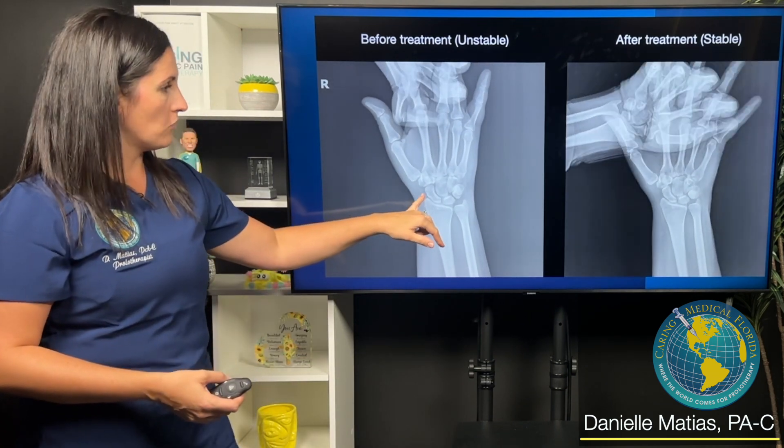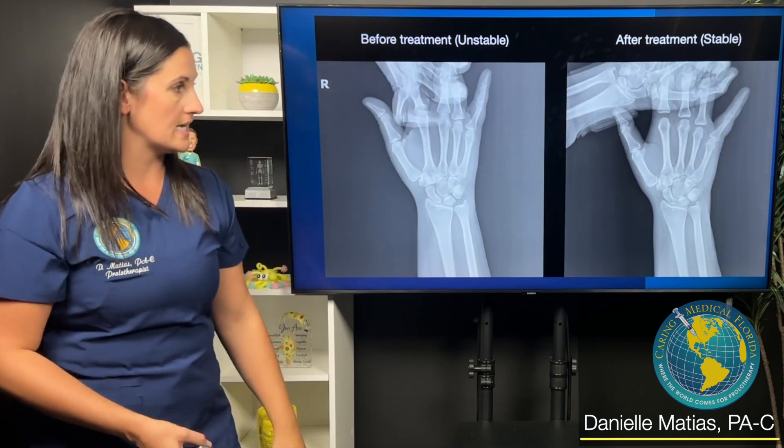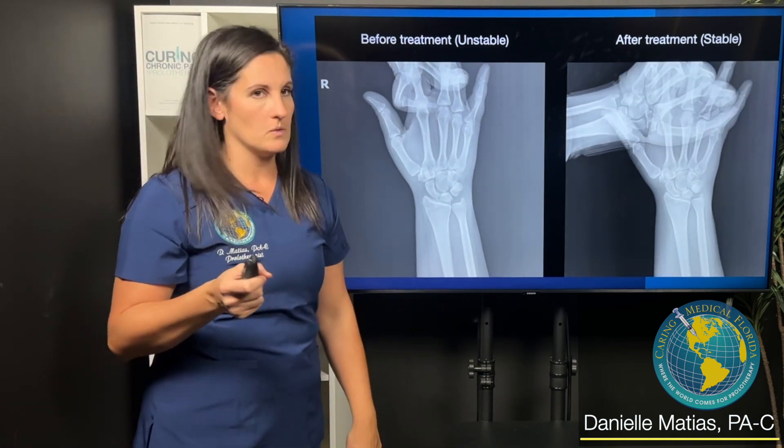Here you can see before treatment and then after treatment — much more stable. And the patient herself even said, 'My wrist is solid,' which is always a good thing to hear.